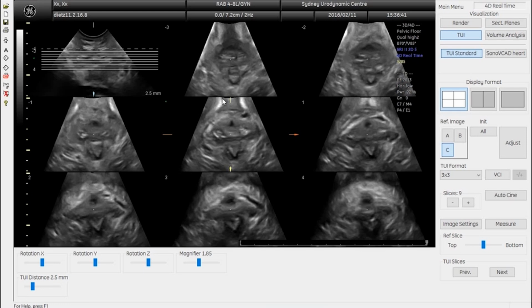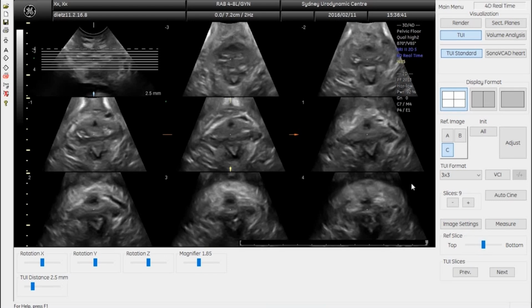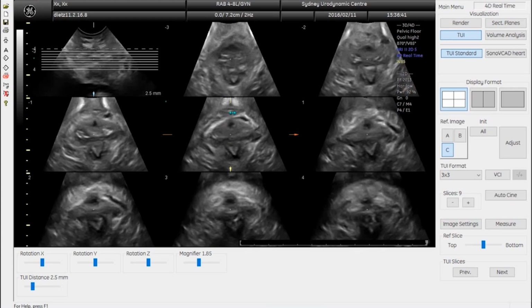The symphysis pubis, these are the pubic rami closing in the middle. We're a bit out. This frame should be here. So we can easily shift that. We make the symphysis pubis close here so that in the middle we can just about see the pubic rami join. We also ought to rock the picture a little because it's not quite symmetrical. It's a little better here. Interslice interval is 2.5 millimeters. The symphysis pubis is open here, closing there, and closed there.